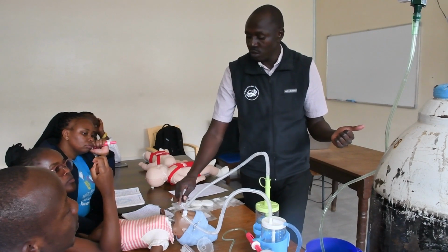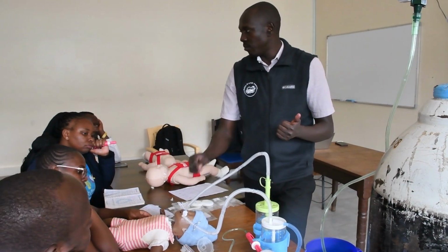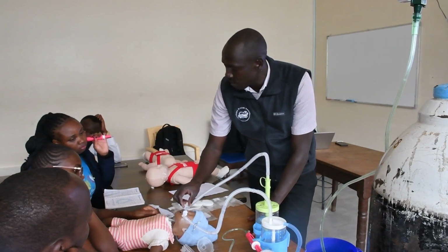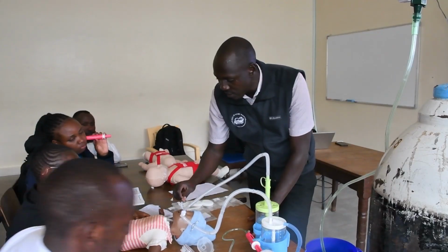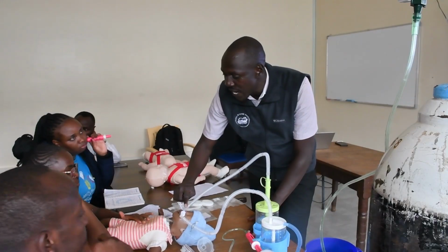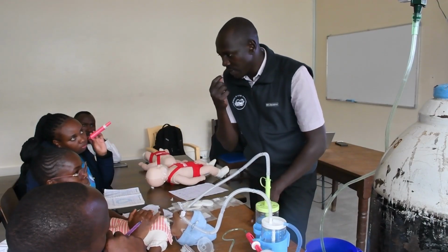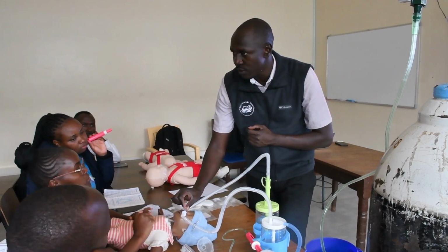Then she also mentioned other important parts to monitor. Prevention of nasal injuries. Be sure secretions are not here. If you see any secretions in the nares, suction wherever you can see. Make sure this area is dry. Make sure you massage the nose. Make sure there is appropriate distance between the columella and the nasal prongs.